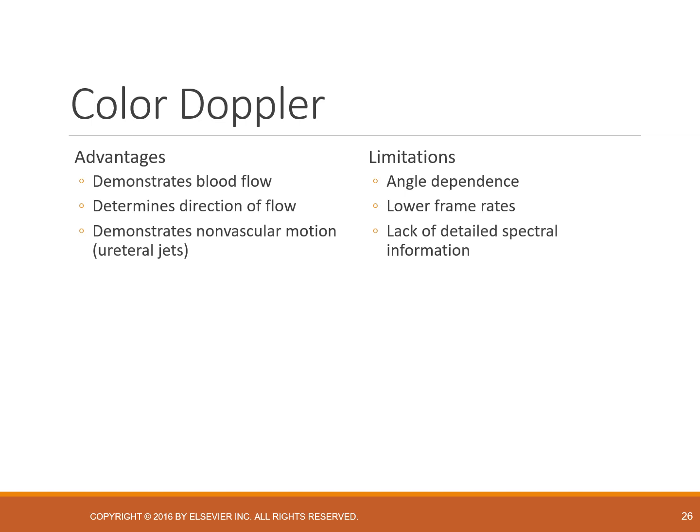It does lower our frame rate, like I said, so your system might start feeling like it's bogged down. And it does have a lack of detailed spectral information. Spectral really referring to not just showing direction of flow, but the velocity of flow. So in order to have additional opportunities to show those things, we have some additional settings.